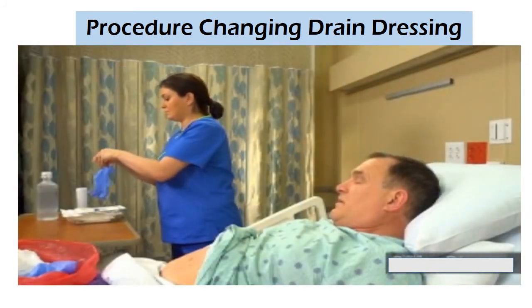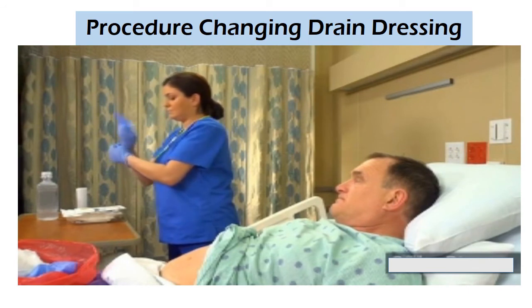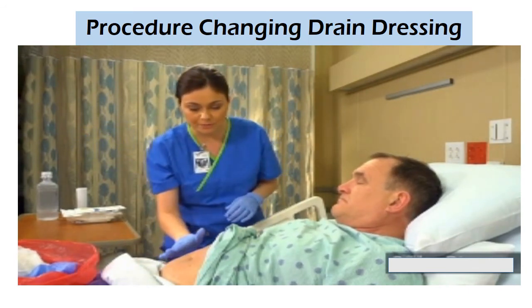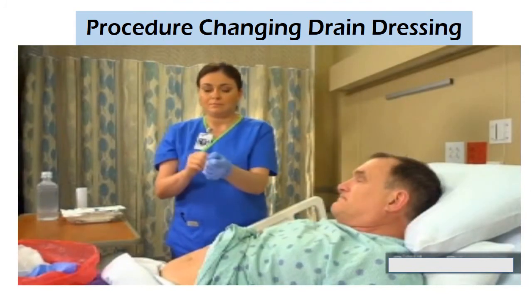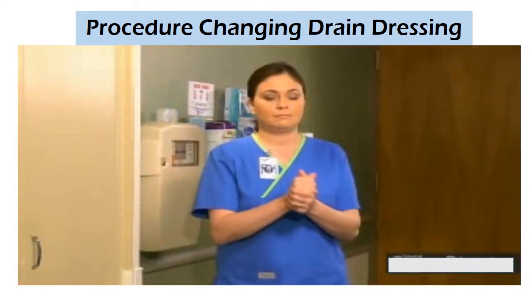Apply another pair of clean gloves and assess the wound. Okay, now I'm just going to assess your wound. Refer to the video skill Assessing Wounds for details. Then dispose of your gloves in the waterproof biohazard bag and perform hand hygiene.